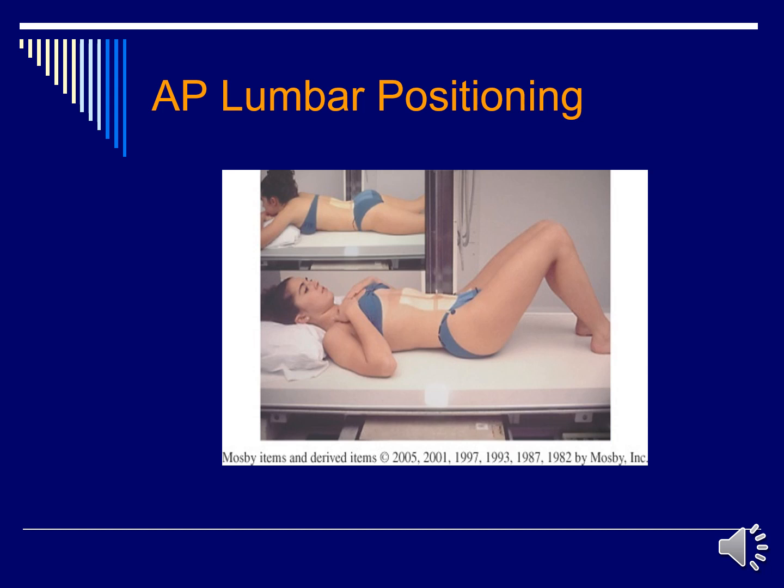Here is an inset picture of a prone patient if you have to perform it prone instead of supine. It's still going to be an iliac crest and mid-sagittal plane.